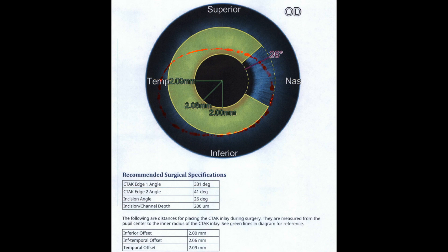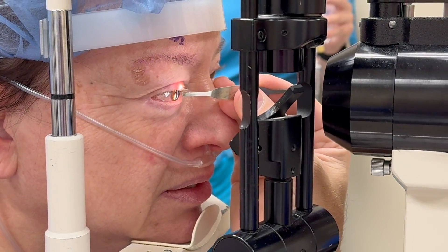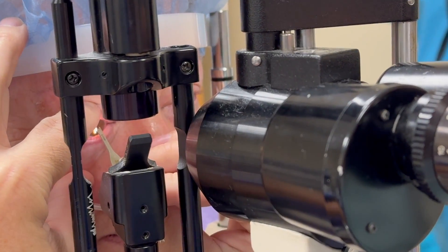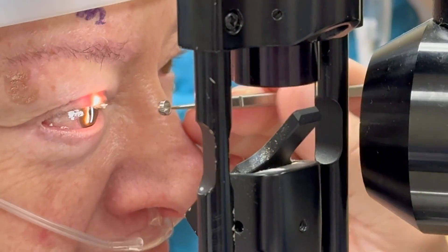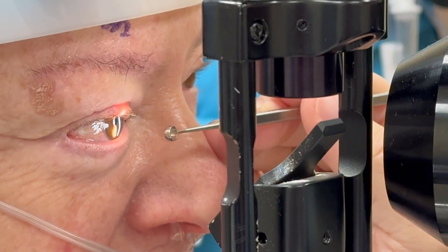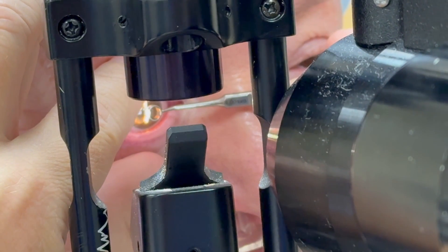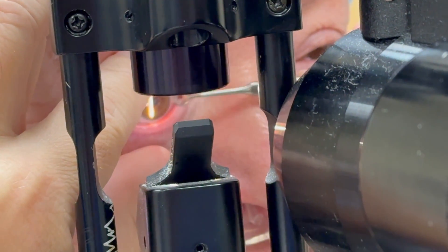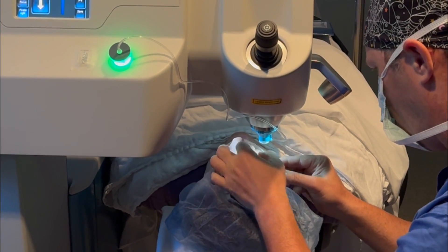This is the surgical plan sent by Corneagen, designed using Pentacam data. It shows where the CTAC segment is going to sit in the cornea and where the femtosecond channels need to be created, slightly decentered from the pupil center. I used a slit lamp to look at the center of the pupil, then used little sizing markers to mark two millimeters inferior and 2.09 millimeters temporal to the visual axis of the pupil center — all based on this surgical map. We then take a sizing ring with an inked marker, mark that center, and align it under the femtosecond laser.